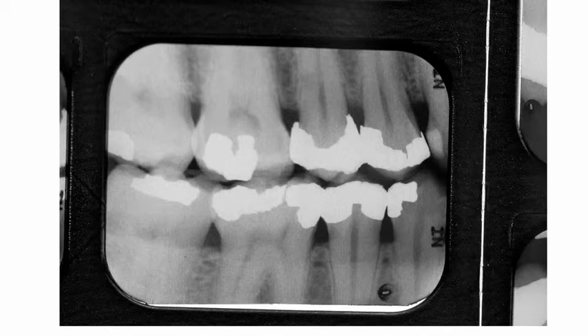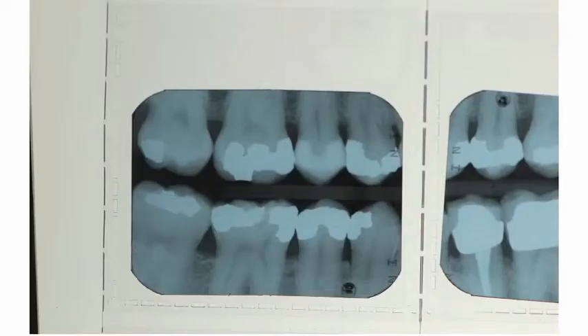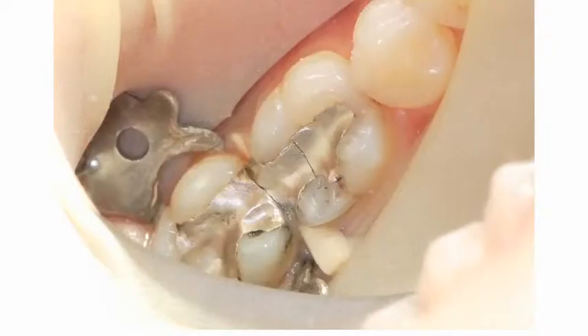This patient presents with the chief complaint of chronic bleeding around the bicuspid. The bleeding is clearly the result of the poor adaptation of the filling material against the tooth. Almost every patient today desires white-colored anatomic fillings. The challenge when working with posterior composites is to obtain a tight, flossable contact. This tooth was pre-wedged to start the separating process, and then four ABC Wedges were utilized to support the matrix band and maintain separation with the Danville Mega Rings.